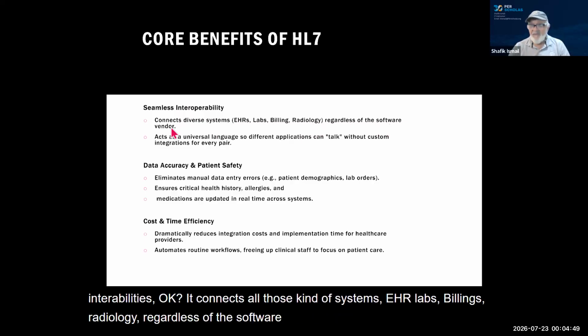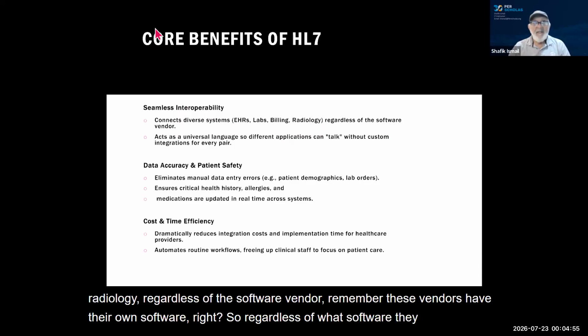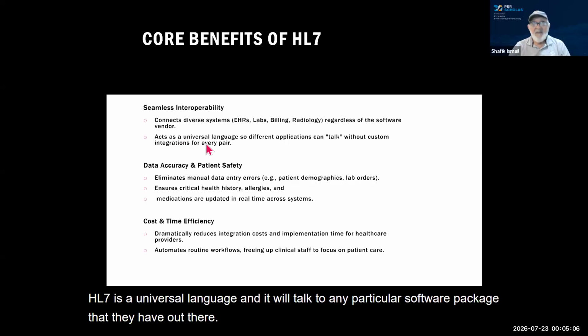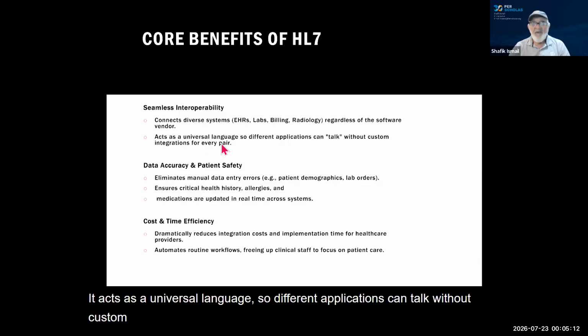Remember, these vendors have their own software, right? So regardless of what software they use, HL7 is a universal language, and it will talk to any particular software package out there. It acts as a universal language, so different applications can talk without custom integration for every pair.